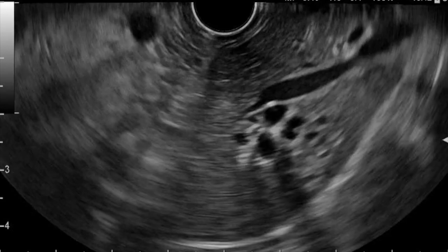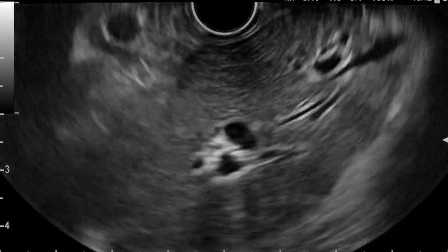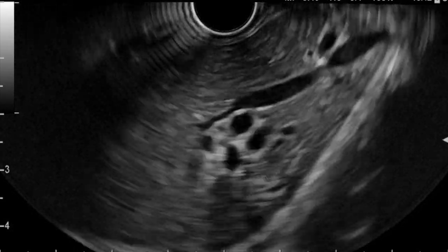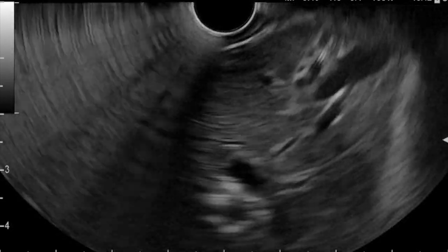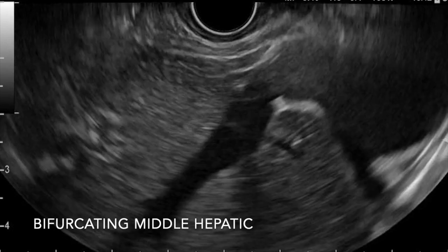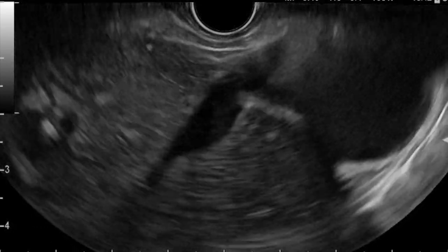In this case, the bile duct is also very dilated and is bigger in diameter than the left portal vein. Usually the bile duct should be smaller than the adjacent portal vein branch and therefore obstruction should be considered. Don't forget, of course, that a bile duct can appear equally as large in diameter after a cholecystectomy or liver transplant. As you rotate, you will view segment 1 and 4 and see the middle hepatic vein.